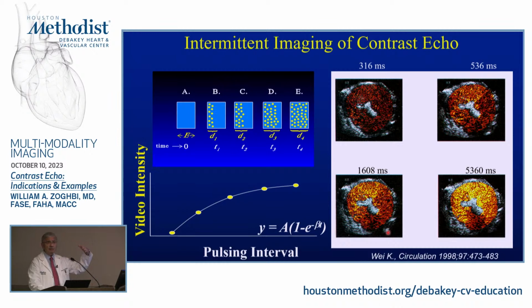Part of the problem, in contrast, are we talking about perfusion study? Yes, perfusion study, okay. Part of the issue with contrast per se is these contrast microbubbles are coming into the arteries, into the capillaries, right?